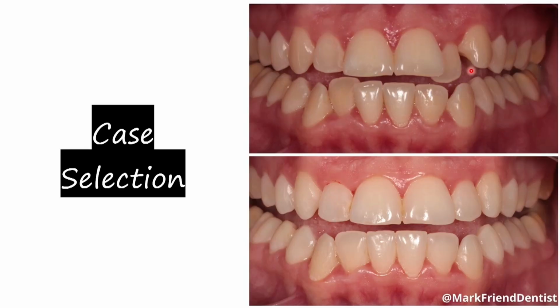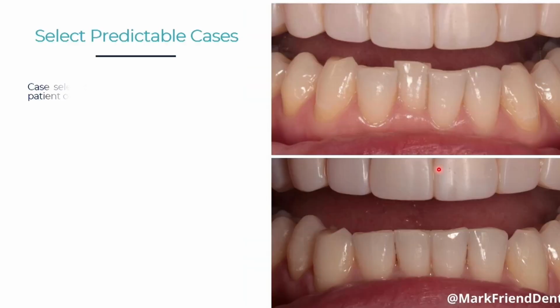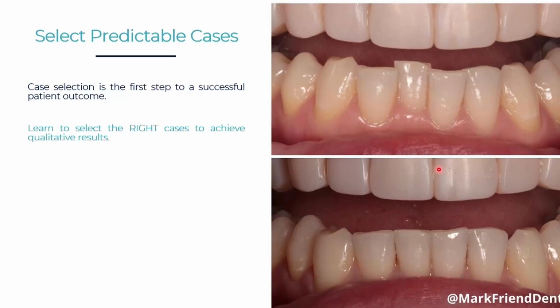However, the moves that we were able to adopt on this case were simple, and so that may well just push it in the lower end of moderate for my liking. This case was treated in 14 aligners with no refinements, and a really nice aesthetic at the end, and really helped improve that smile.